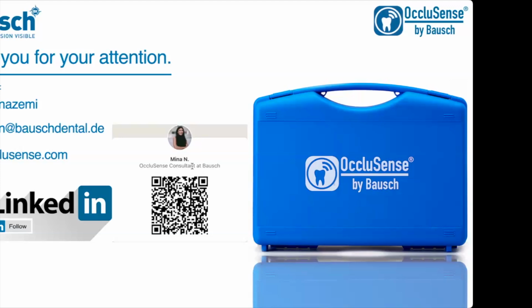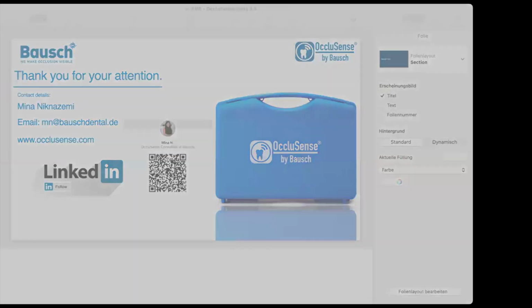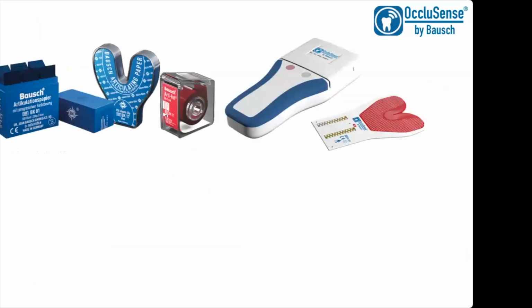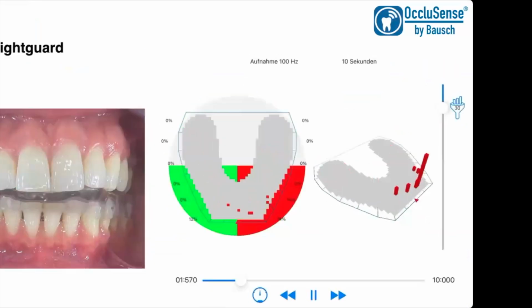And the other two questions. So Night Brux Checker is the one that we used, and the other one with the millimeters of the splint. I can only speak about the Brux Checker, because the OccluSense, I understand the bruxing behavior, but we still have to tell here the Brux Checker is showing us the unconscious bruxing and the OccluSense is showing the bruxing, how the patient is doing it in the chair. So a little bit of difference. Absolutely, that has to be highlighted here. Yes, definitely.